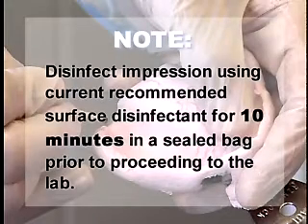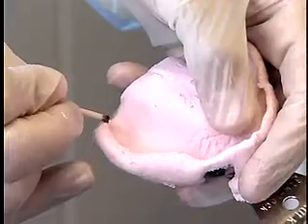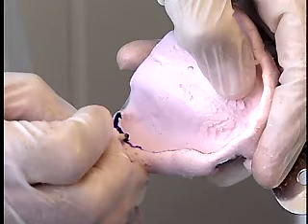Disinfect the impression using the current recommended surface disinfectant for 10 minutes in a sealed bag prior to proceeding to the lab. Alginate impressions tend to be overextended, so the denture outline should be drawn on the impression with an indelible pencil. This outline will be transferred into the cast and will be helpful to fabricate the custom tray, and will also be transferred to the labial sulcus.